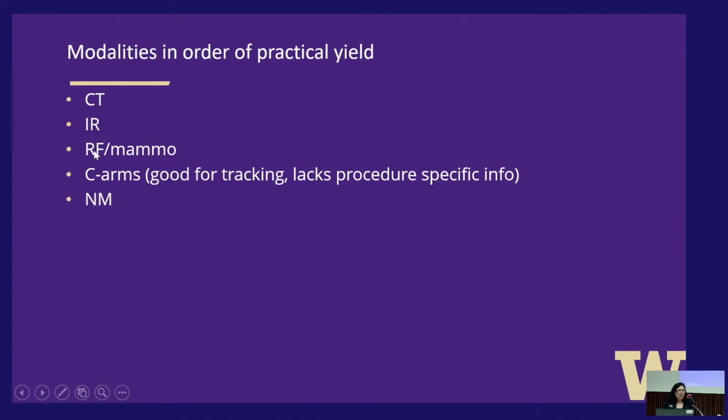We don't do a lot with RF and mammo because the dose is so low, but I can still go and look at mammo for a full exam versus just left side or right side if I want to look at the dose. Tomosynthesis versus full field digital mammography. But we haven't done a lot with mammo. Our whole focus has been CT and IR.